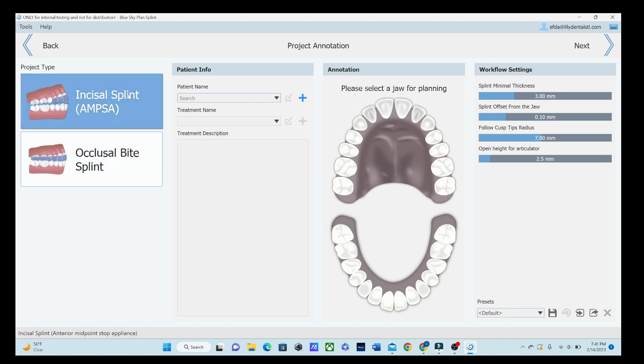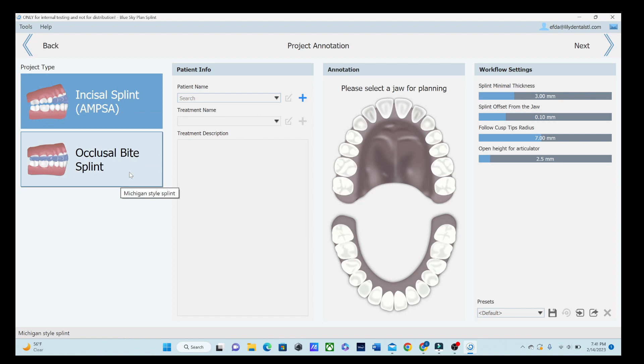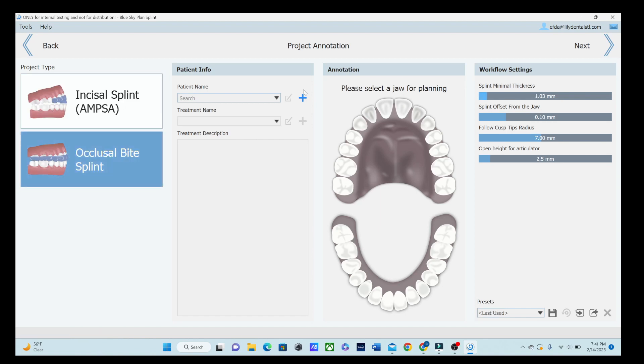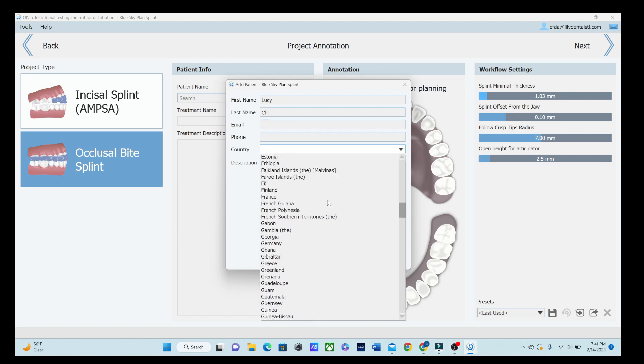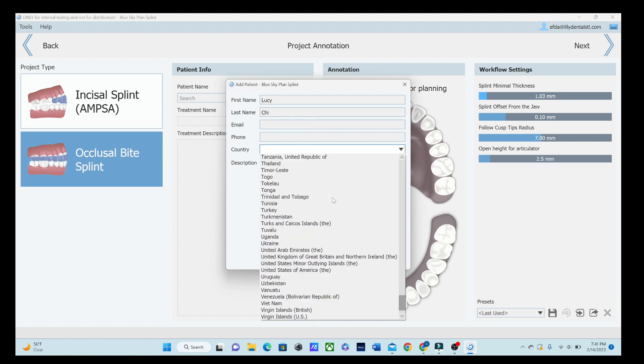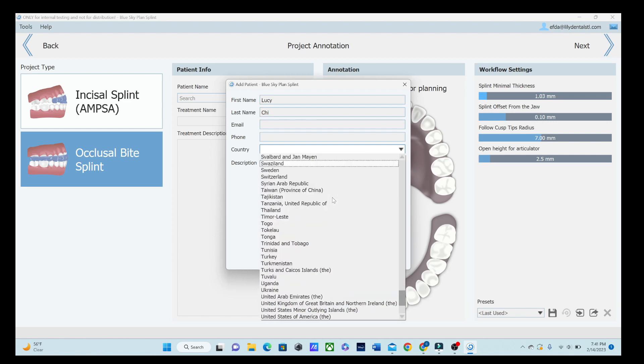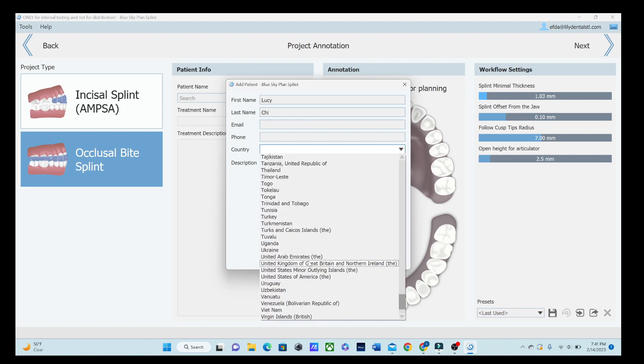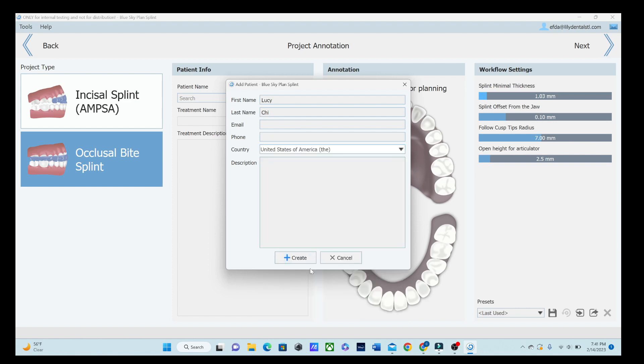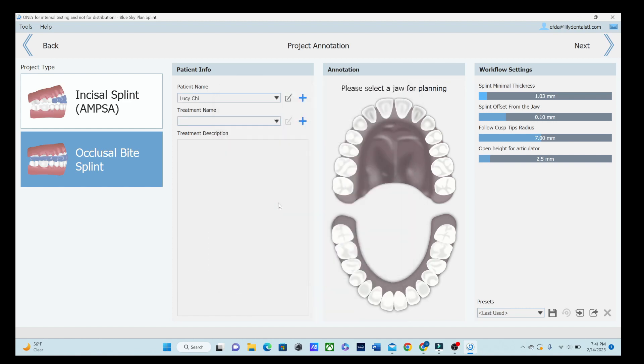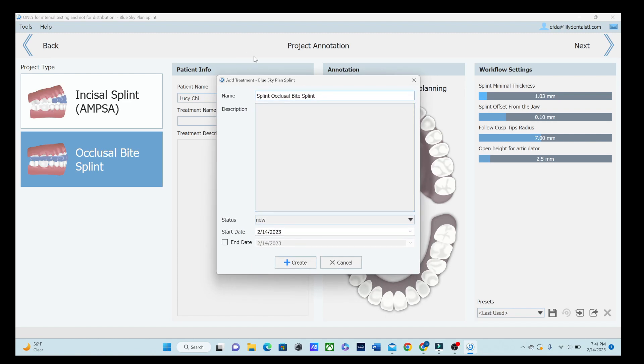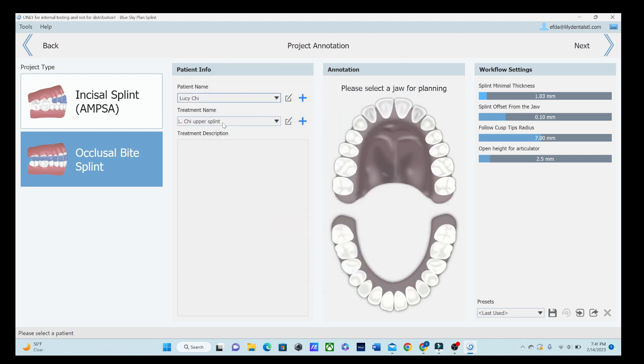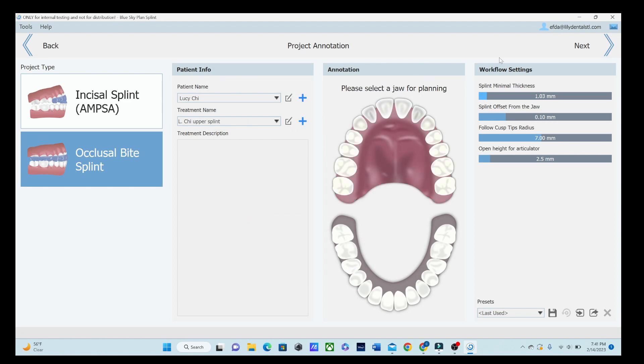You can either do that anterior deprogrammer or just an occlusal bite splint, which we're going to do. We are going to add a patient's name. We'll just make up a name. Don't need an email, but it does need a country. I'm in the United States. And we're going to create that. So we've created her name and then we're going to create this. I always like to name it with their name, upper splint, and that automatically puts the date in for you, which is nice.